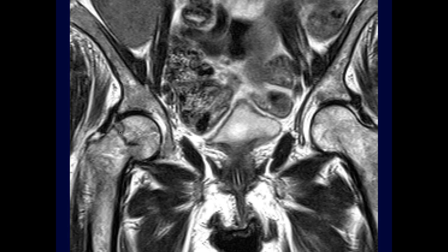Yeah, and in my experience with these fractures that are on the lateral side like this, if you can see, this is unstable, the head is actually shifted. See, the cortex has shifted here. So this is really not a stable fracture. And right at the base, the vascularity comes from the neck. My experience with a few of these that I've seen that they tried to preserve is that they all ended up going into necrosis. Well, once they go into varus, you're in trouble.